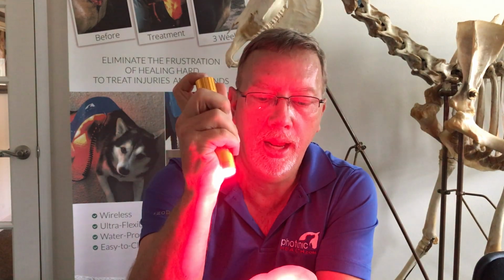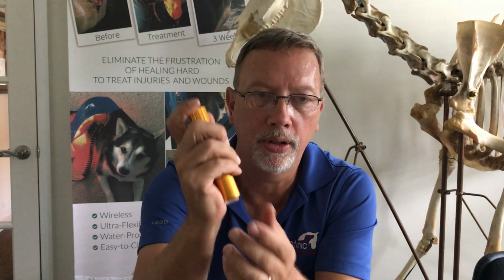If for any reason you lose the frequency, back off the cap about 2 turns, push in the button, turn it back together, and hold for about 5 seconds. It should reset it to turn the frequency on, or you can turn the frequency off that way. I recommend just leaving it alone. Don't mess with the frequencies. If it's working for you, don't try and play with it. Just put it on low, then high, and have your frequencies to be able to use.